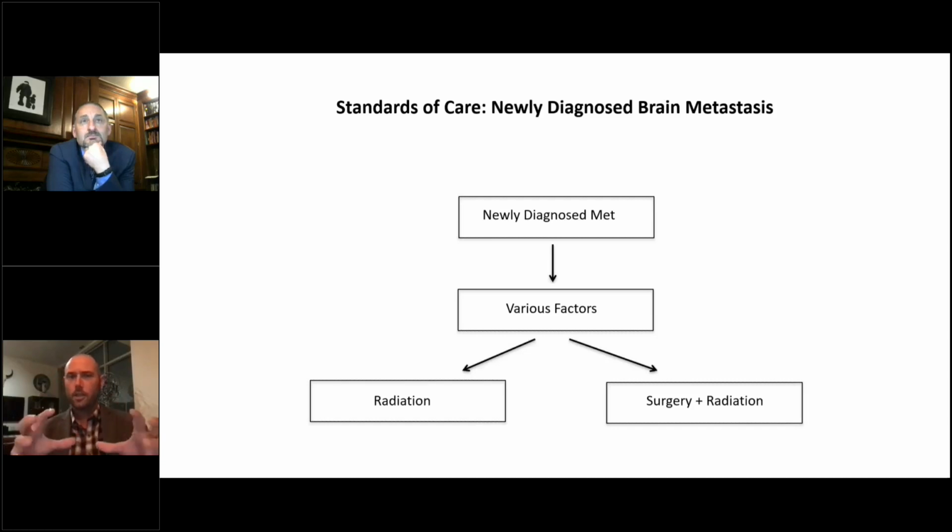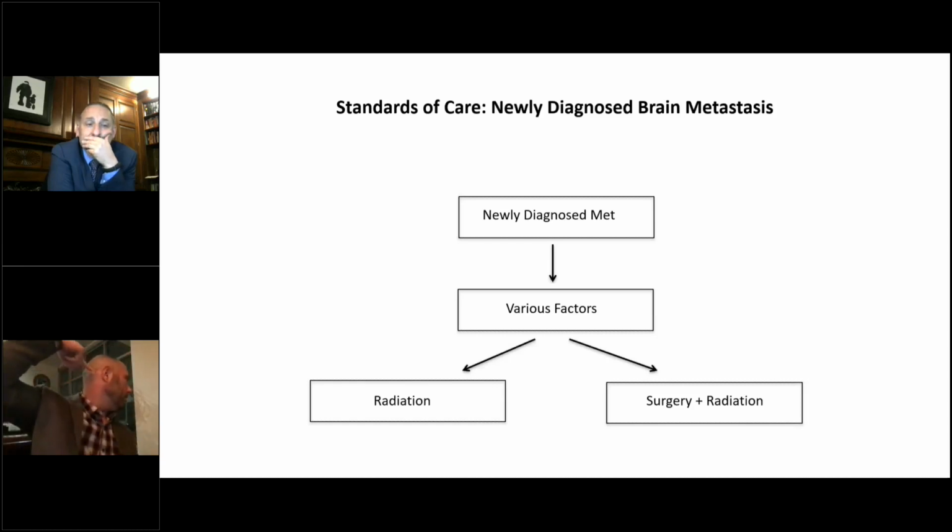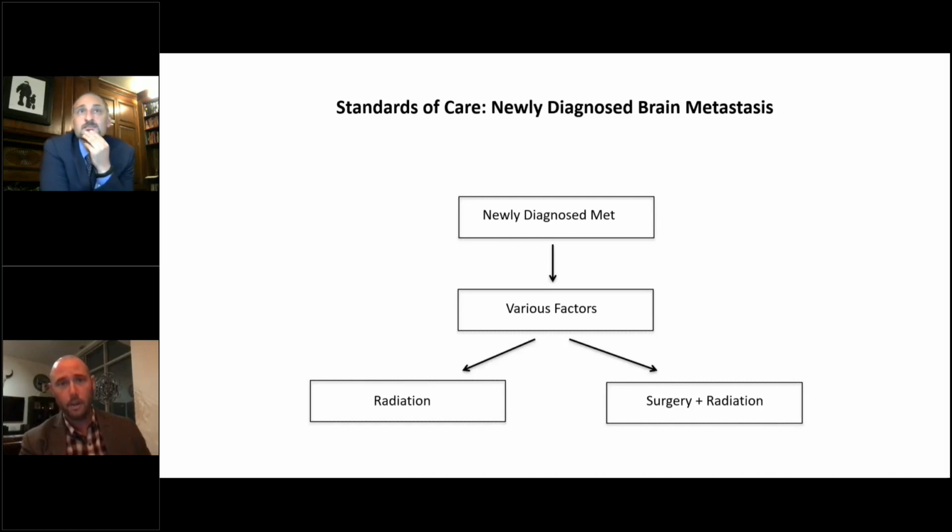In general, with these kinds of surgeries, it's not like a craniotomy where you want the lesion at the top of your field. Oftentimes, people are pretty straight supine so that the cables can just come straight out this way, and you can biopsy obviously from any angle and laser from any angle. So the positioning is a little bit different. That's an issue for posterior fossa lesions. What I've found is that most of the posterior fossa lesions I've been willing to do are the ones where I can keep the patient supine with a bump like this, which means for the most part trying to come from a retrosigmoid approach. Then the cables can come out and just turn a little bit into the magnet bore. So the 2 lesions that I've done so far in the posterior fossa recently have been retrosigmoid approaches with the patient positioned supine, which is an easier way of avoiding some of those technical limitations. And I do worry about swelling, so I've limited myself to about 2 centimeters so far.